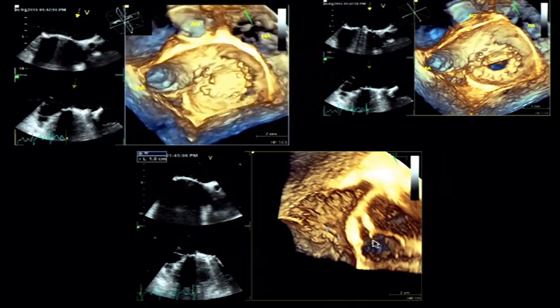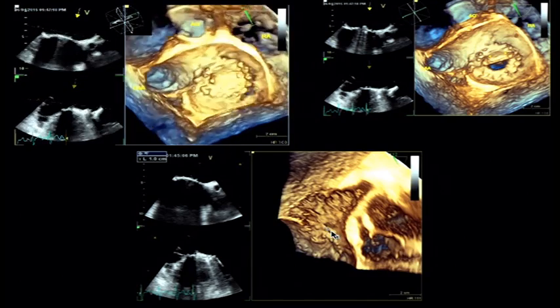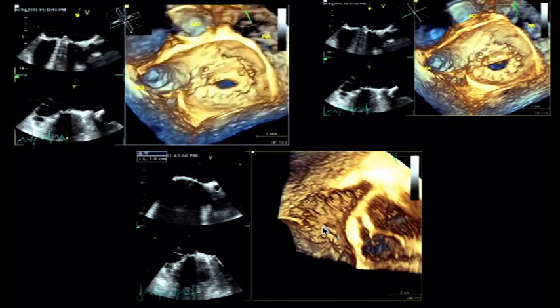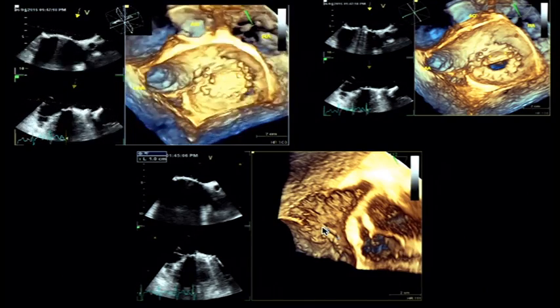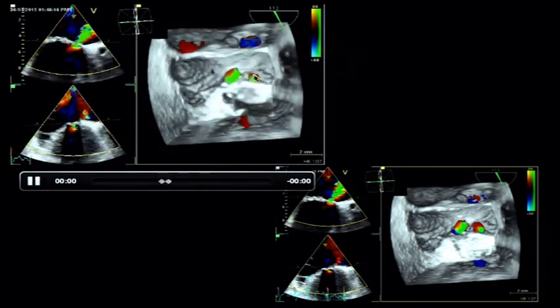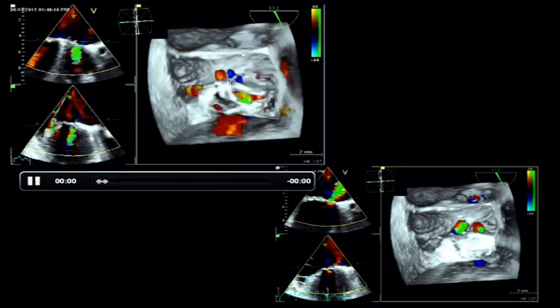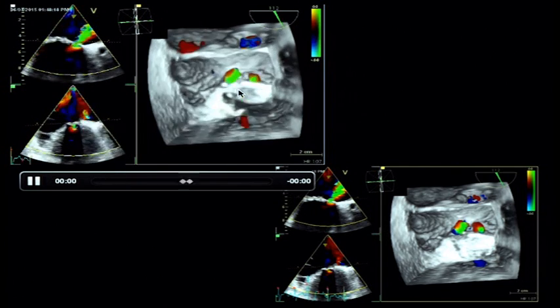This is the left atrial appendage, your aortic valve is here, and what looked suspiciously like a small paravalvular leak. So this is a little bit of a complex scenario, and the color shows two jets here, one coming through the orifice here, and then one coming at the area beyond the sewing ring here. This is the paravalvular leak here.